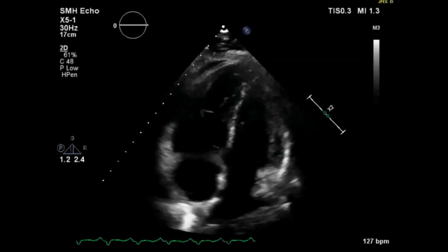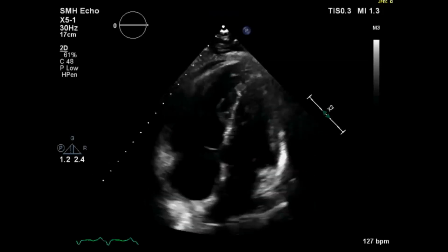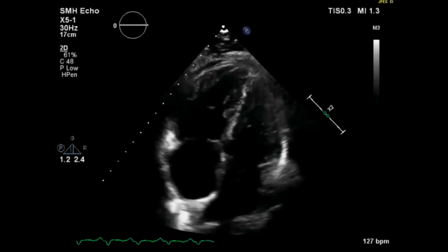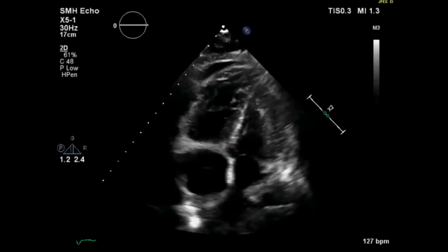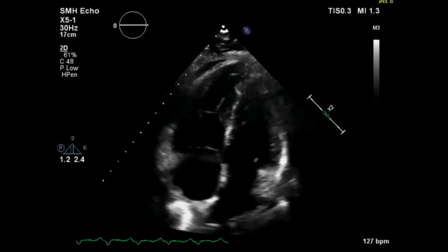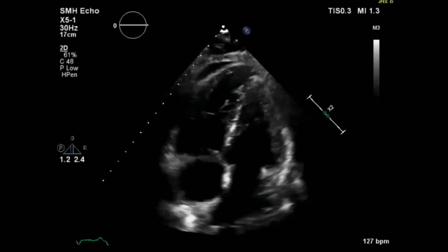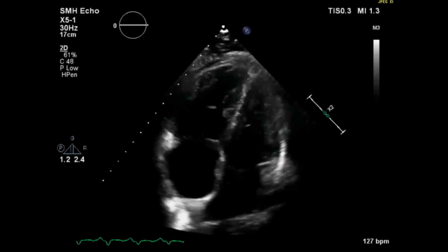So they said that some of the theories are that the apex is still supported by the muscular part of the LV. The free wall is thin and cannot resist the afterload in front of it, but the apex still has some power from that LV. That's the theory behind why it's spared in pulmonary embolism.